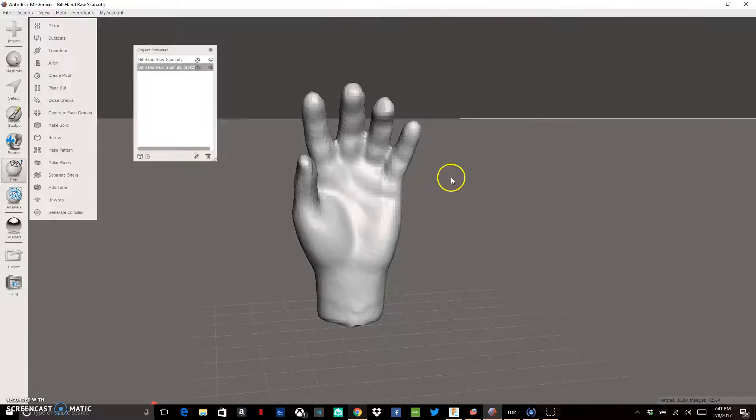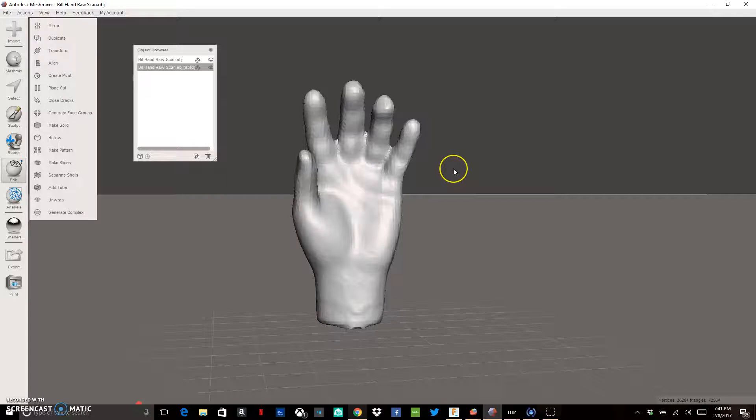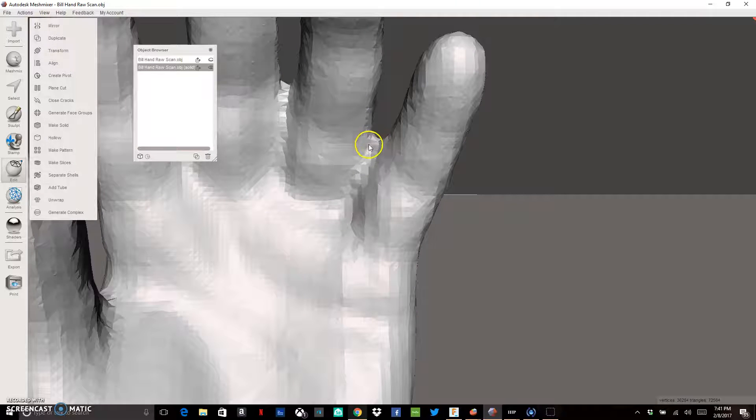Our next step is to start cleaning up this scan. Unless you're really good or lucky with your scanner, with fingers you're probably going to get some kind of webbing appearance where it melds two fingers together towards the knuckles. We need to clean that out. We'll zoom in close and get rid of it using a specific process — a couple of steps, but actually pretty easy.